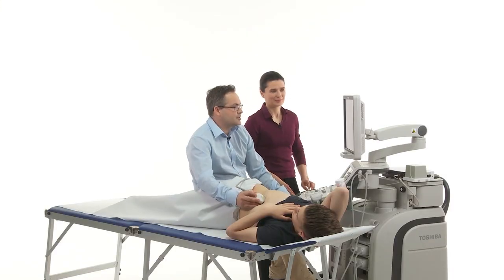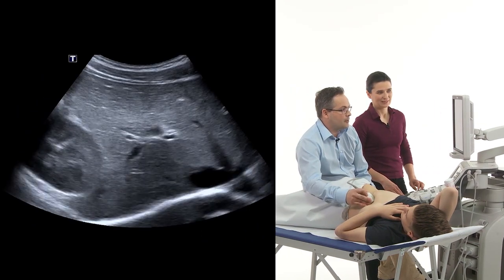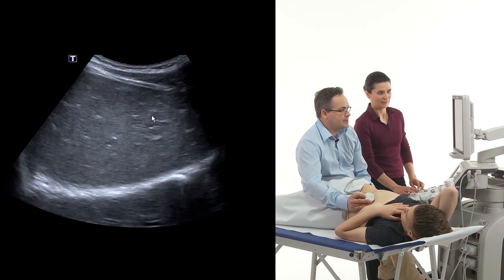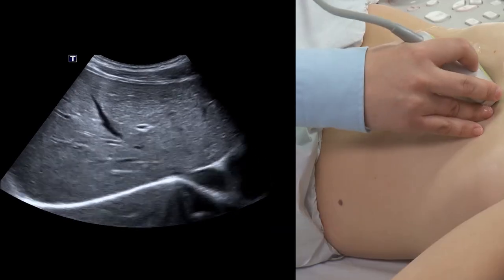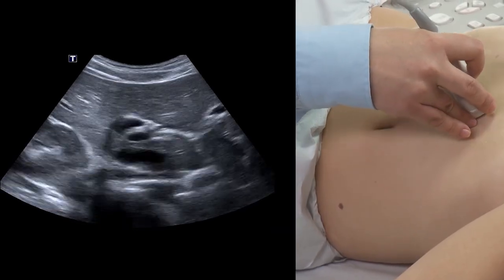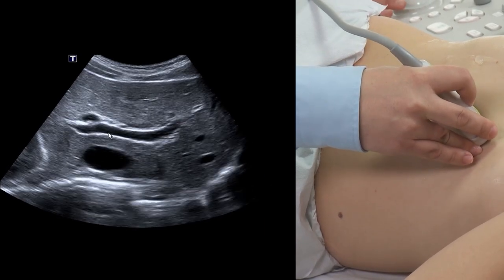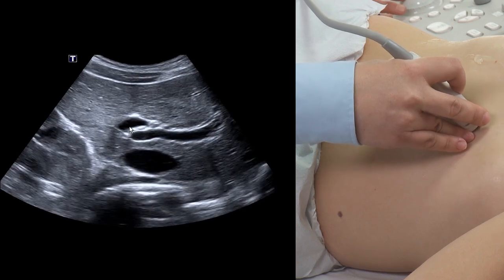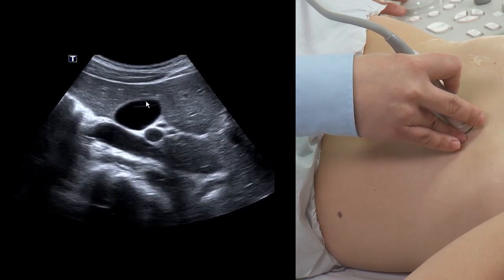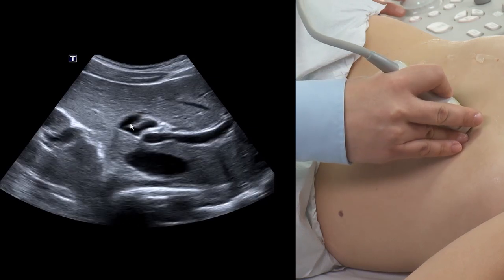The next approach I use is from a subcostal oblique view, where I want to find the porta hepatis, the center of the liver. Please take in a deep breath. And I tilt the probe downwards. Ready to see here. To find the porta hepatis. Here's the portal vein. And now when we look on the left side of the screen in the near field, we can identify the gallbladder over here, beautifully seen.